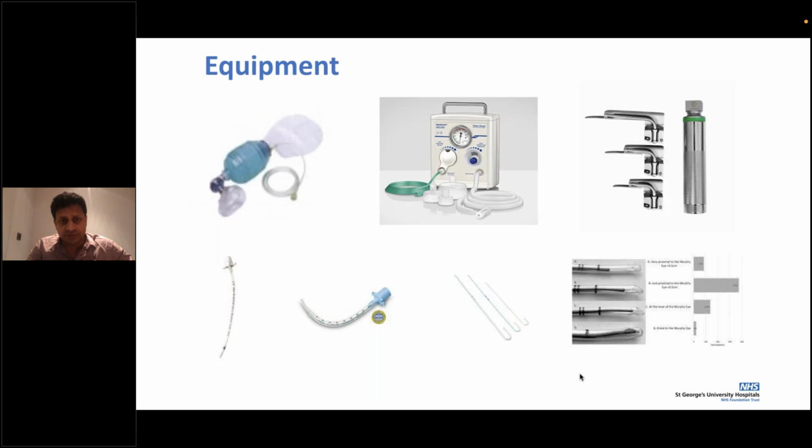I've put a picture of that in the lower part, the light blue one. Now, the Coles tube is only narrow at the tip, and beyond that it is slightly wider. The aim is that you don't have slipping of the endotracheal tube further beyond the vocal cord, because there is a restriction where the tube is widened. Some units prefer that, and the thought process is that accidental extubations may not be as frequent.